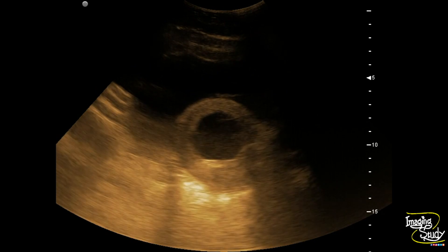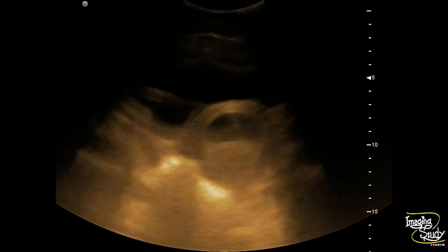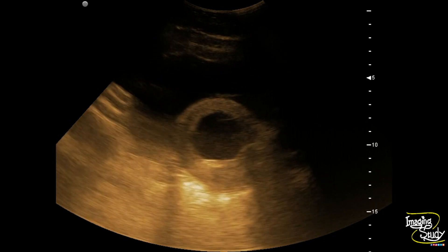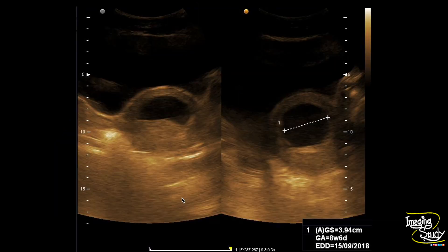You can see a well-defined gestational sac. There is no internal embryo or yolk sac. To call it a blighted ovum, we must go for measurement. We have taken the gestational sac diameter of this patient, and it was 39 millimeters, indicating eight weeks and six days of gestation.